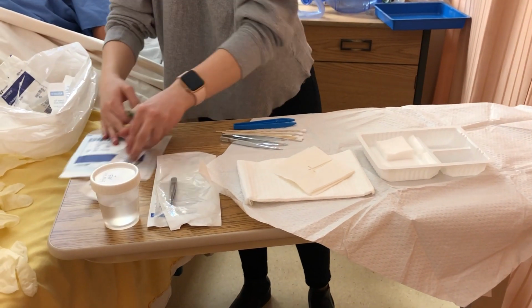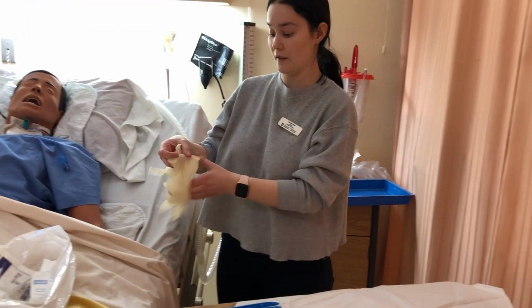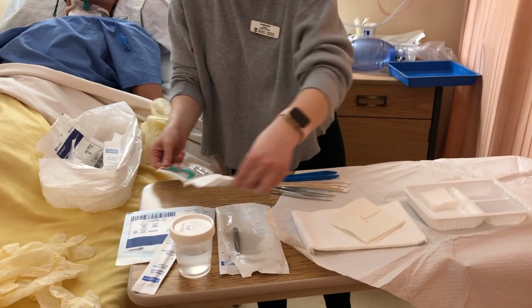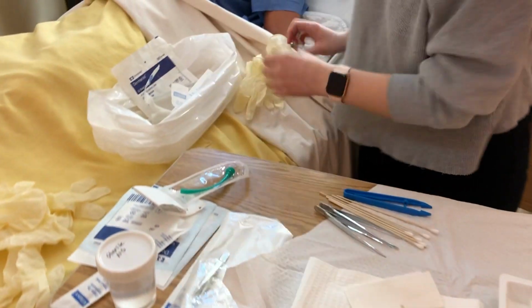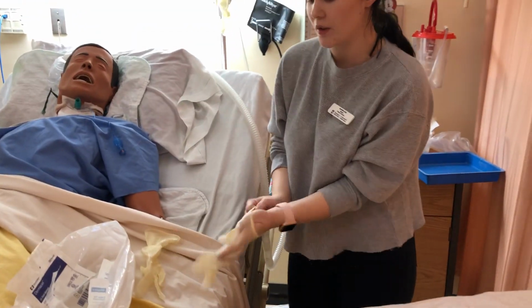Now that I have that, I'm going to put on new clean gloves. Actually, I'm just going to open up my inner cannula packaging. Okay. Perform hand hygiene and put on new clean gloves.